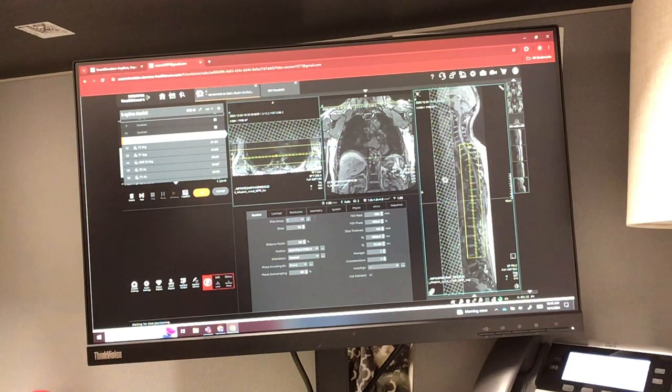So when you're doing this coronal localizer, we're going to count the vertebrae, and it's nice that we get this composed scout, so now radiologists can count all the vertebrae. They can see if there's an extra one or not. But we just want to make sure that in these slices right here, we're catching the spinal cord, and we want to get all of the thoracic vertebrae in there.